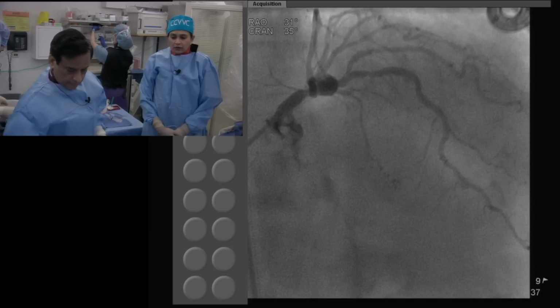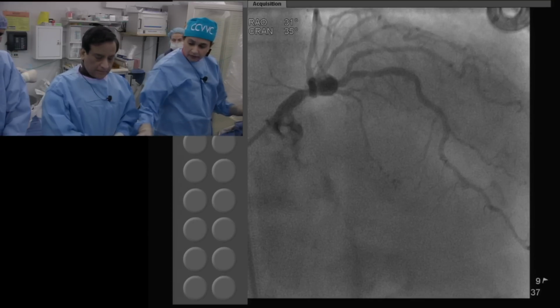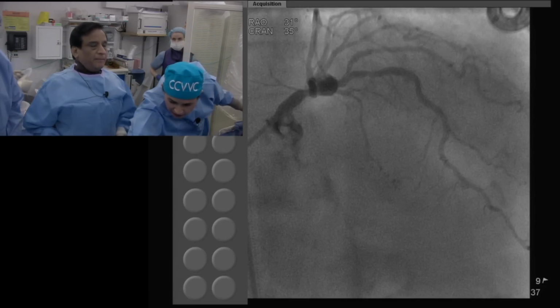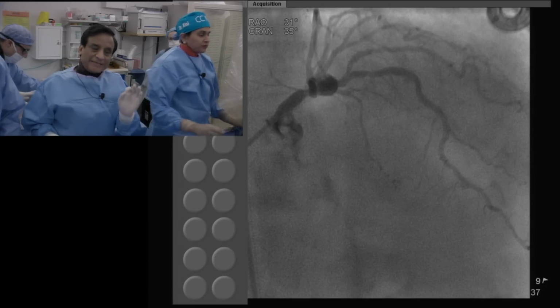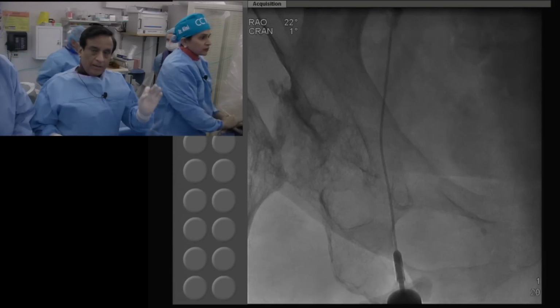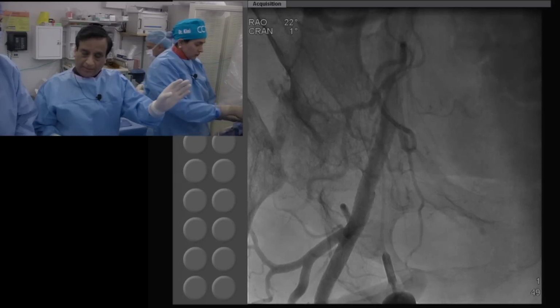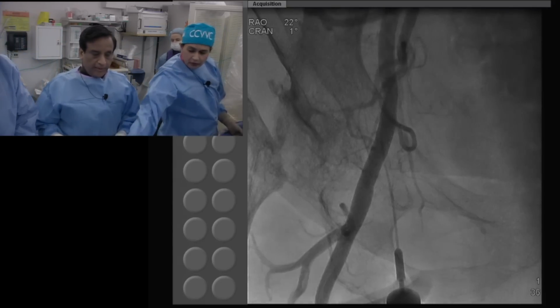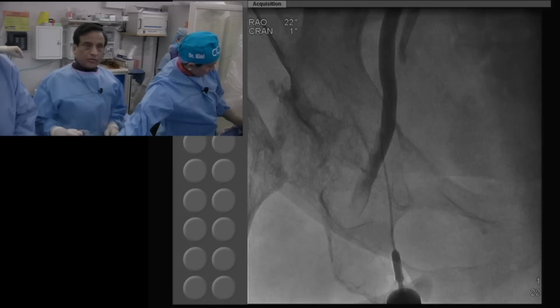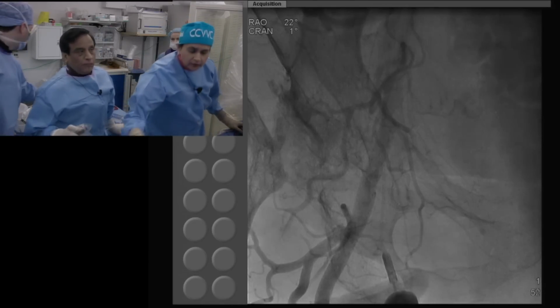You are probably going to be using rotational ablation here? Yes. What about hemodynamic support? I know the EF you showed looked 40 to 45%, maybe even normal. No need for any hemodynamic support? No. We expect at this time that no, but if somebody wants to use hemodynamic support, this is exactly the type of patient for which the FDA approved Impella, those who are high risk, even high risk coronary anatomy, which this patient has, because they may develop acute decompensation during the procedure, even for a short time, when we occlude the left main, and put in an Impella.